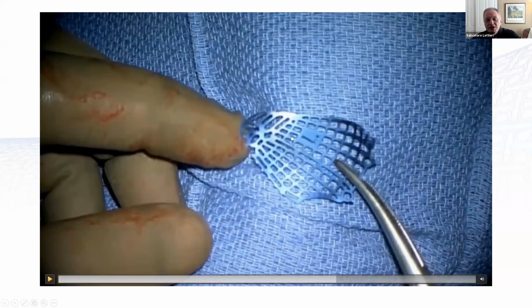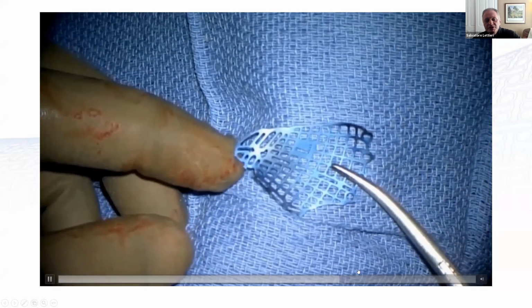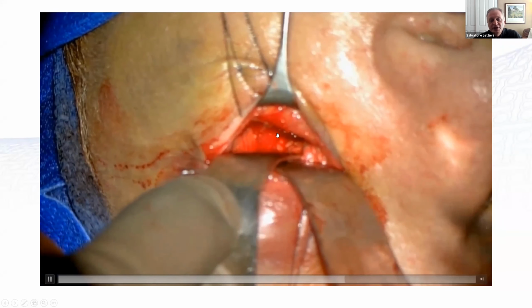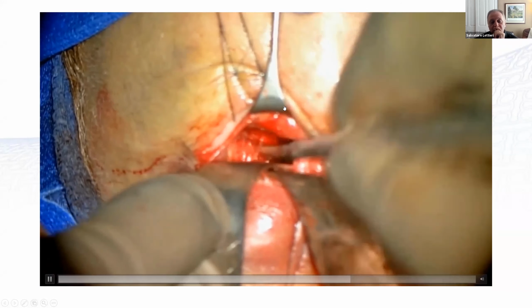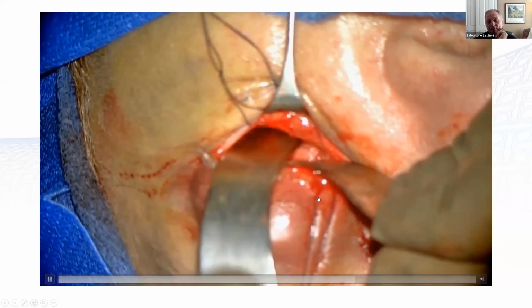Sorry. So that's what I'm demonstrating here, just a touch of a bend, and that'll rest on the posterior shelf very nicely. And then go back, do the doggy paddle, reduce everything, look at the posterior shelf, and I actually have an endoscopic shot here I'm going to show you in just a moment. And then once you've done that, have all the fat reduced.